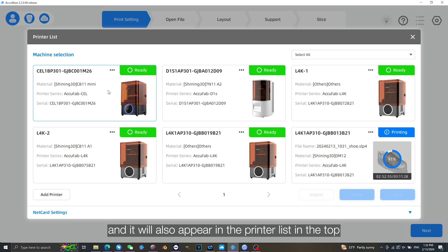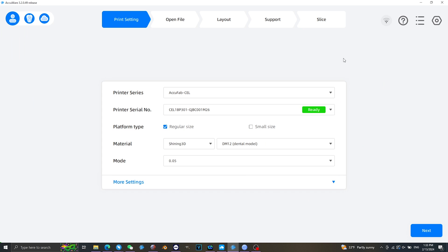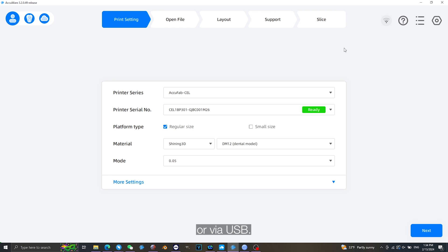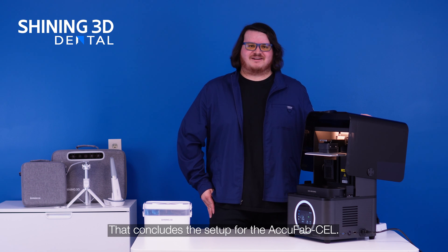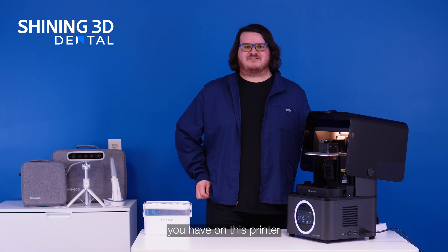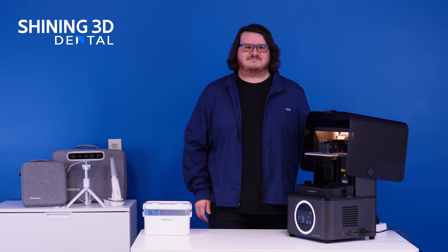It will also appear in the printer list in the top right corner. Now that your printer is connected with AccuWare, you can nest files, slice them and send them directly to the printer over the wireless network, through ethernet, or via USB. That concludes the setup for the AccuFab-CEL. We are looking forward to any feedback you have on this printer, and excited to see any products that are made from this. Thank you so much for watching.